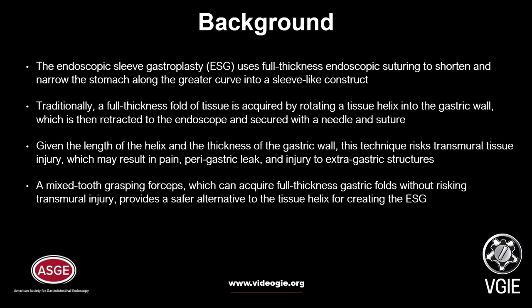Mixed-Tooth Grasping Forceps, which can acquire full-thickness gastric folds without risking transmural injury, provides a safer alternative to the tissue helix for creating the ESG.